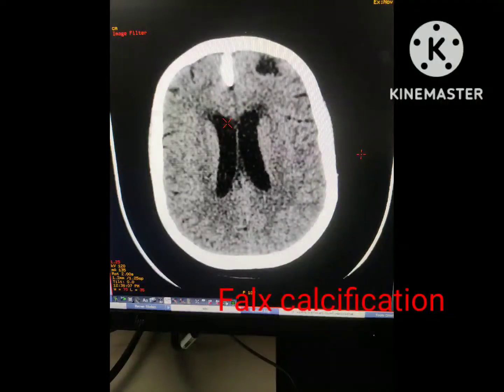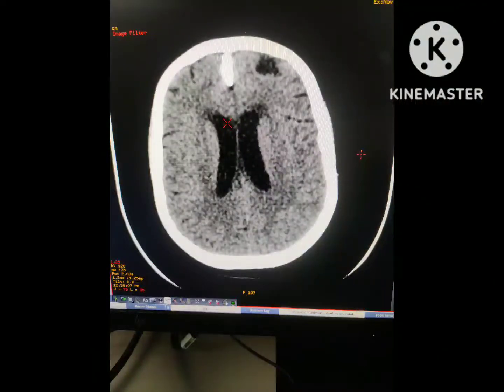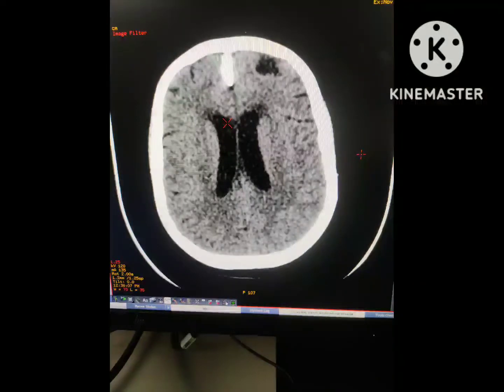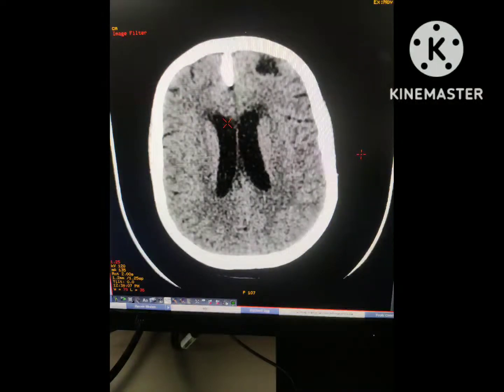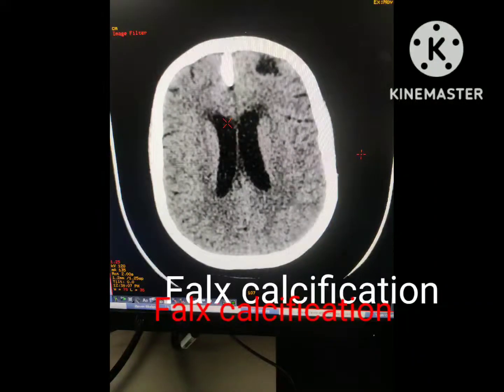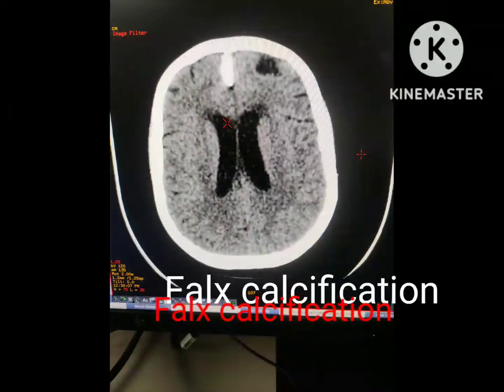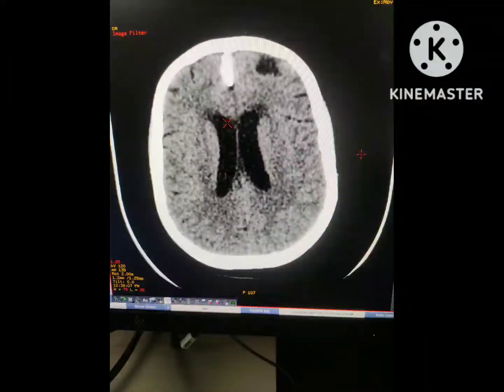Calcification of the falx is a very common finding on the CT scan. In fact, it is an incidental finding most of the time. This calcification is physiological in most of the cases and there is no clinical significance.